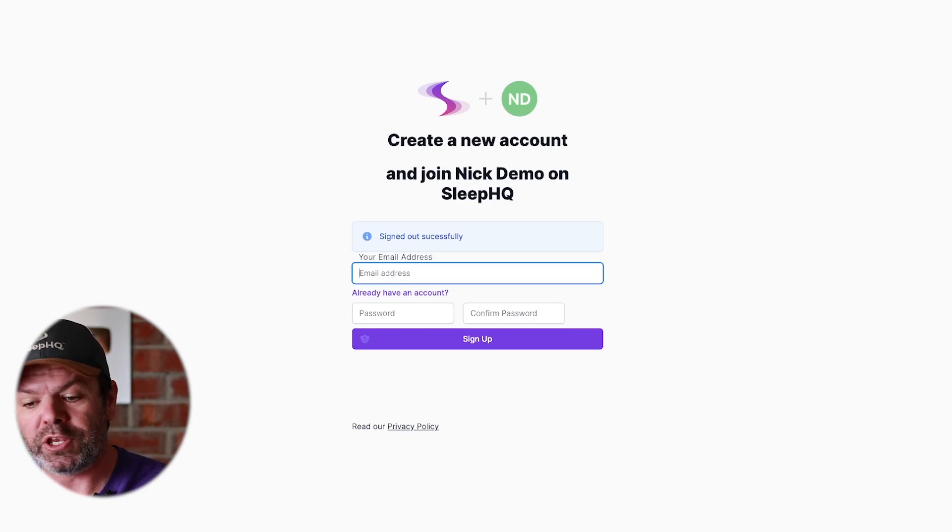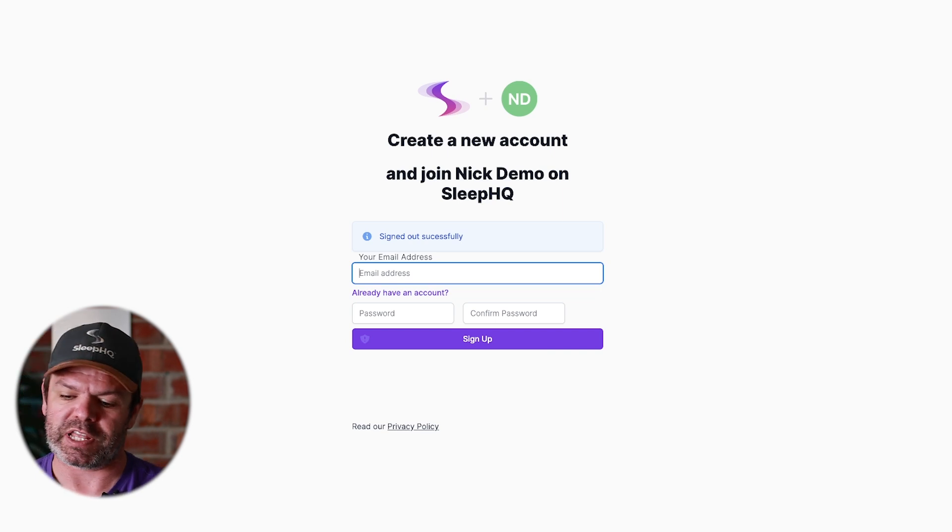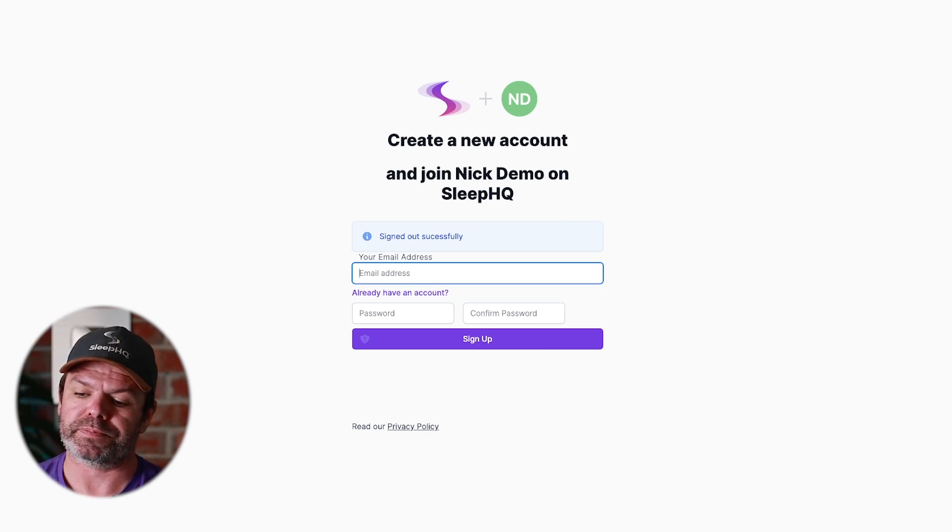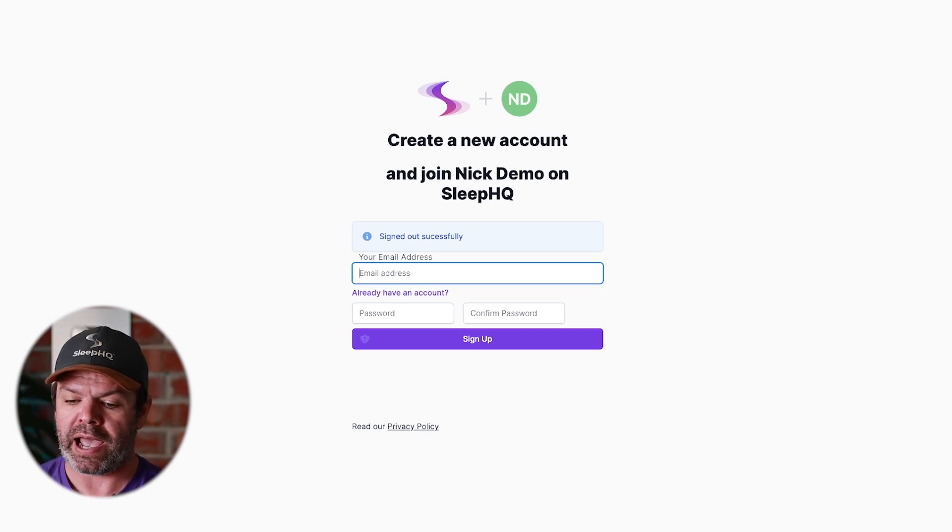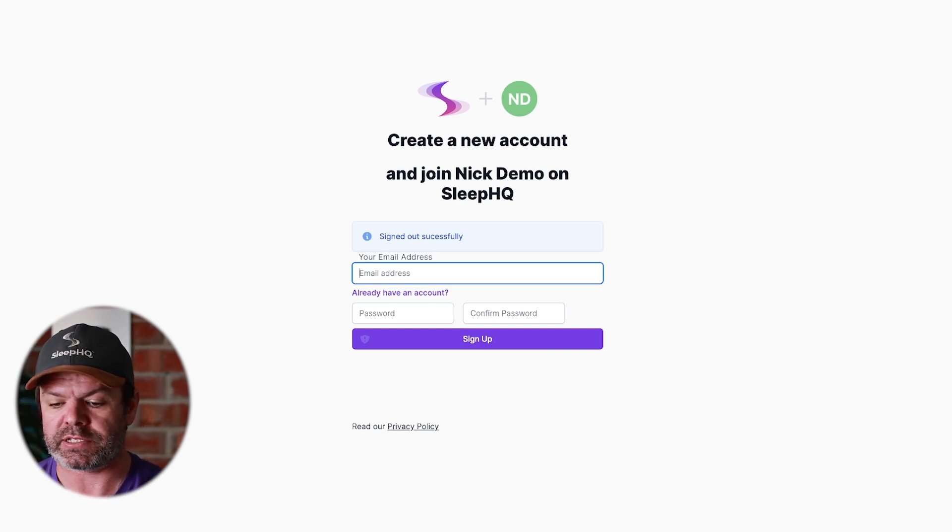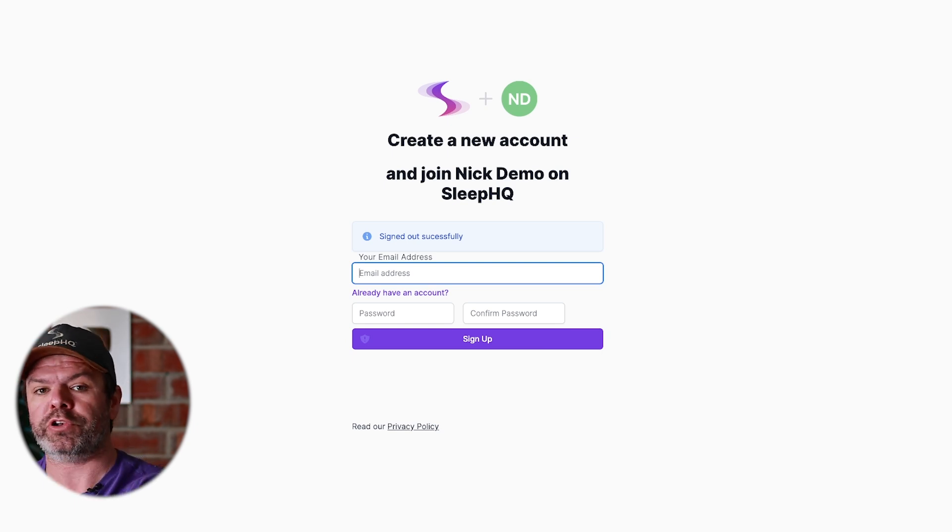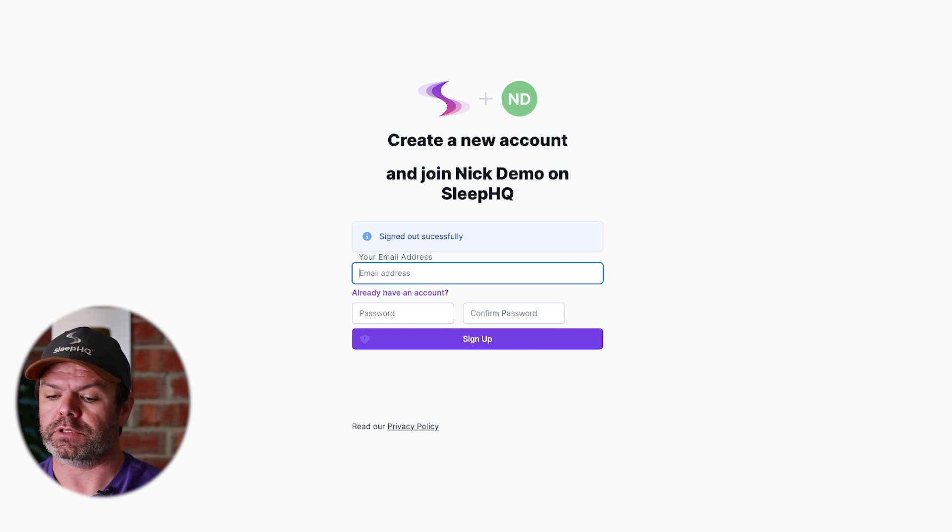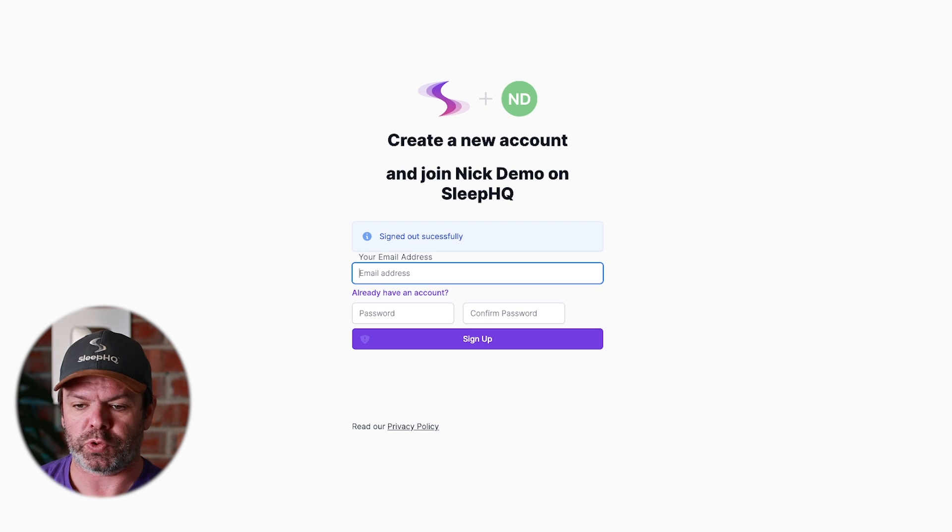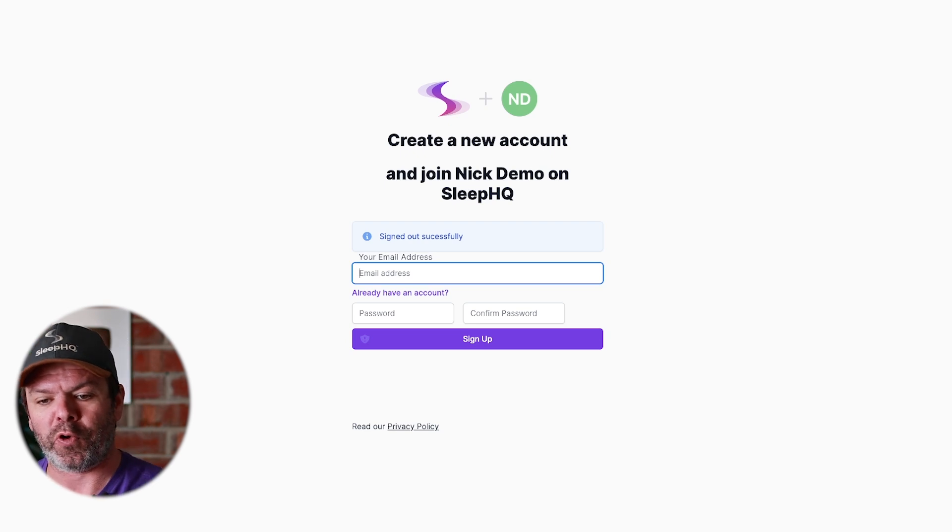Create a new account and join Nick Demo on Sleep HQ. So the patient will add their email address, create a password, sign up, and then whenever they upload data, you'll have access to it on your end.